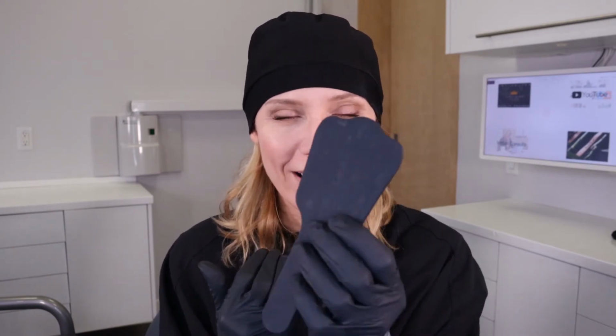And so this is the paddle, and these are awesome, especially if you're doing aesthetic cases, you want to have some of these. If you as a patient experience this, it's because we're trying to really just highlight the upper teeth. So we put it in the patient's mouth like this. And what it does is it takes away all the background noise. If I just showed you a picture of me like that, then my tongue would be in the picture, my lower teeth, and that's just not so pretty.